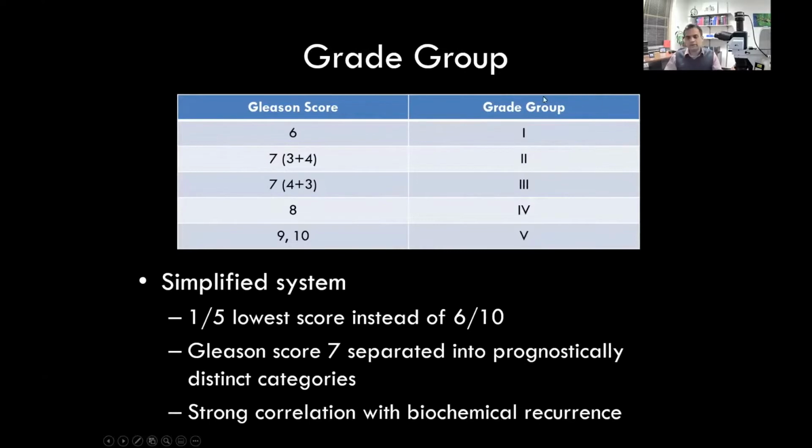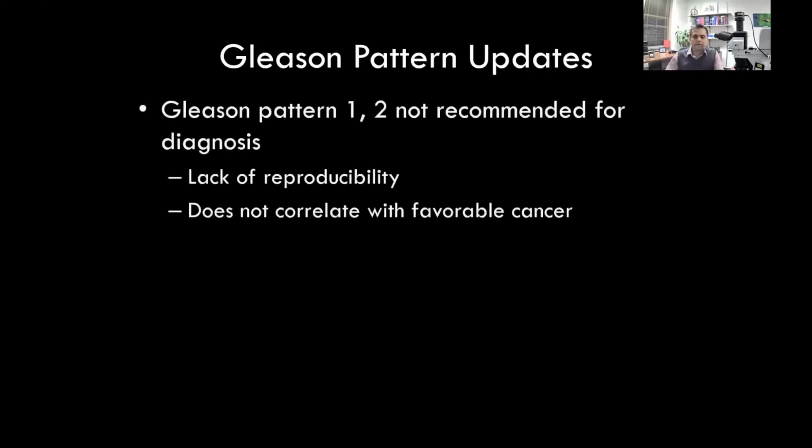So it really works, and this is what we are adopting right now. We still give the Gleason score, and in the next line, we also say what grade group it belongs to. So, let's look at some updates in Gleason patterns themselves. The first update is very simple.